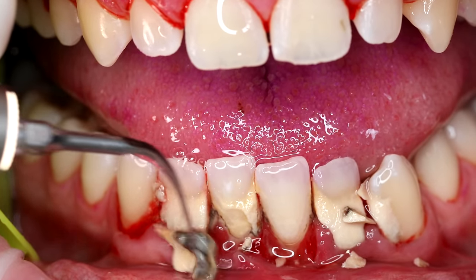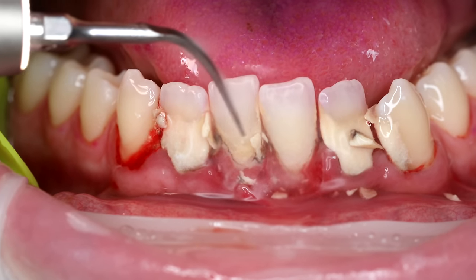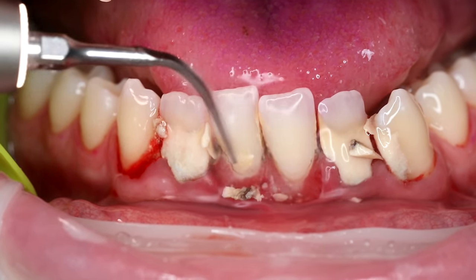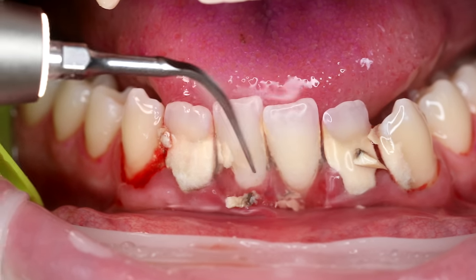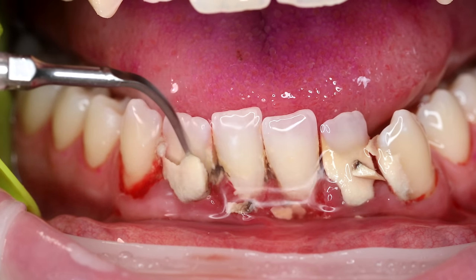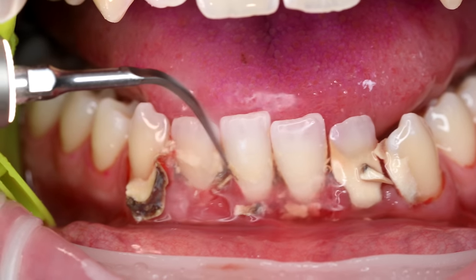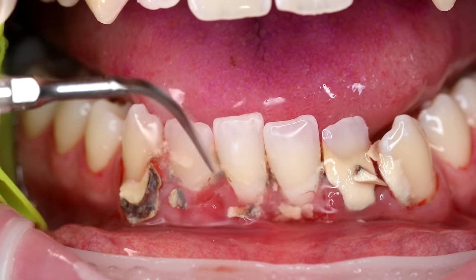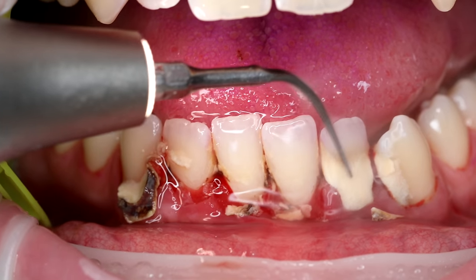They have to be used by a licensed dental professional, but they vibrate at 25 to 30,000 oscillations per second, assisted with water to help keep it cool. If you run one of these without water, it gets super, super hot. We're able to remove large amounts of plaque, tartar, and calculus and food debris super quickly with one of these. I'm gonna go ahead and cue some time-lapse music right now so that we can all sit back and enjoy this masterpiece be created.